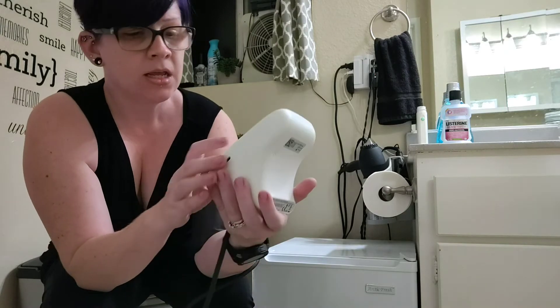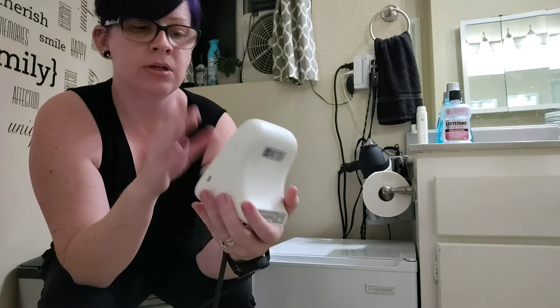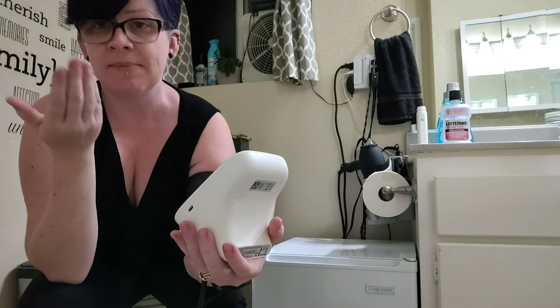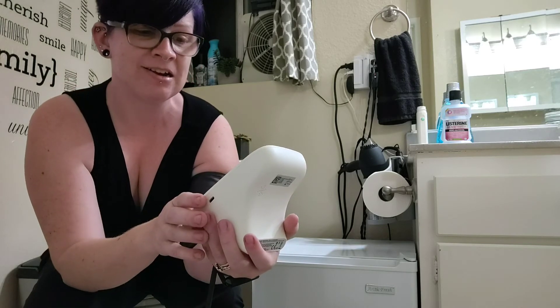These are very normal numbers for me — even that pulse rate. I do have a fast heart rate, but these are all very normal. I like that it says the readings out loud. I can read the screen, but if I didn't have my glasses on I probably wouldn't be able to read the numbers, but I would still be able to hear them.